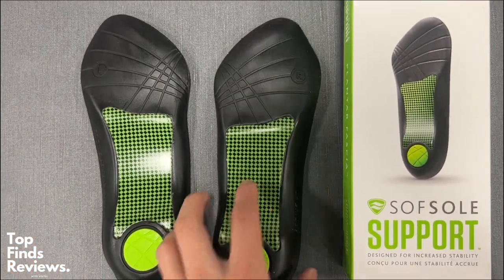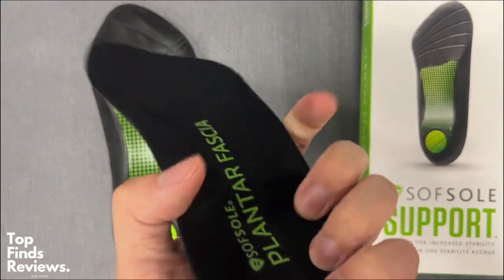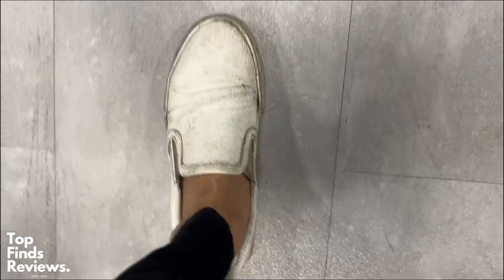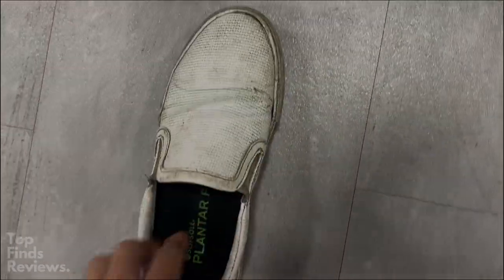These ones are definitely very comfortable. It's easy to slip into an athletic shoe or a regular everyday shoe, mainly because it's three-quarters of the length. The full length one is also very easy to slip in. I prefer full lengths over the three-quarters, but this one is a fantastic insole.